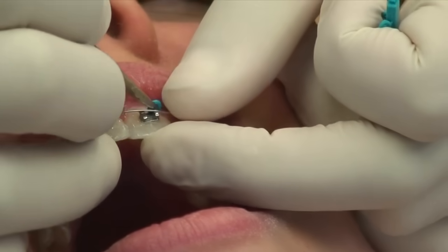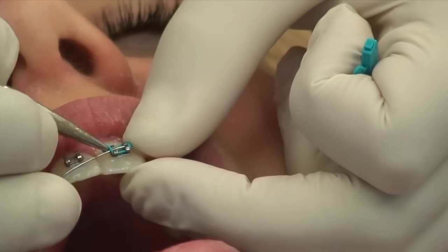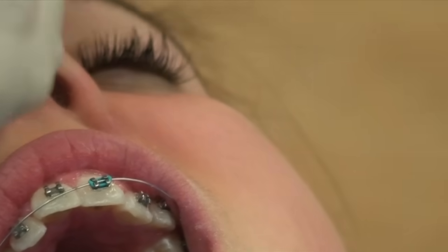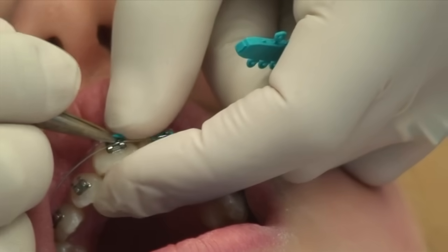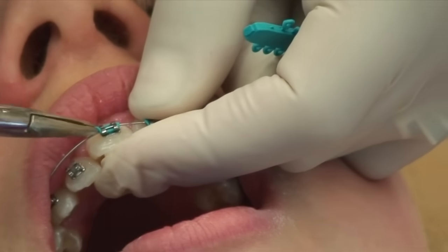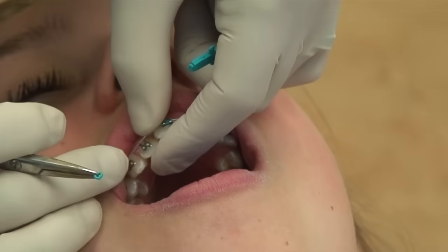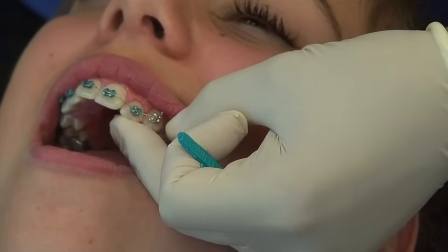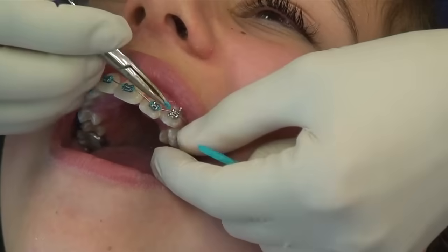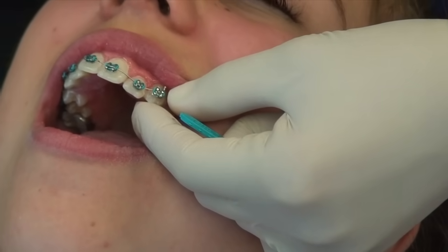And so as we attach the wire to each individual bracket, you'll see that we're putting on her colored ties right now. These colored ties, although they're kind of cute and pretty, really their only purpose is to hold the wire to the braces. Now you'll see this wire starts to get distorted as we go into the more crooked teeth. And this wire, like I said, once it hits body temperature, starts to return to its original straight shape. So as that wire over time straightens out, the wire that you can see is crooked becomes straight, and as the wire becomes straight, the teeth become straight.